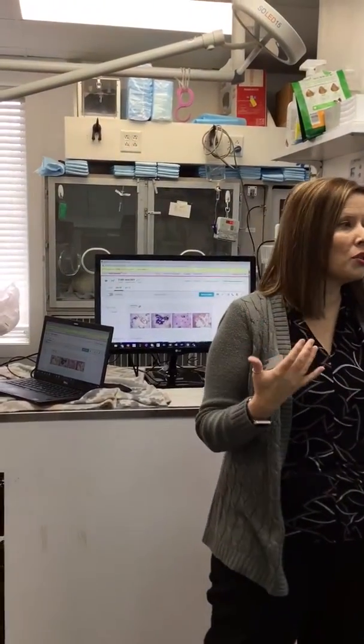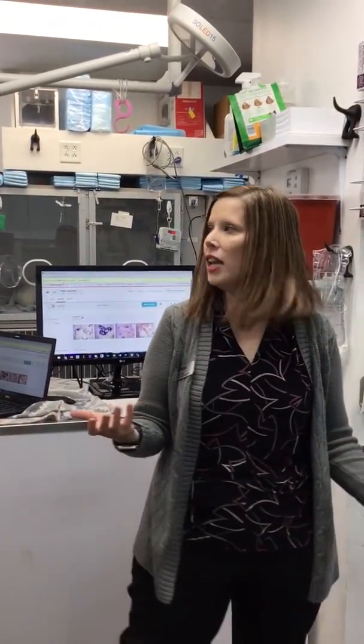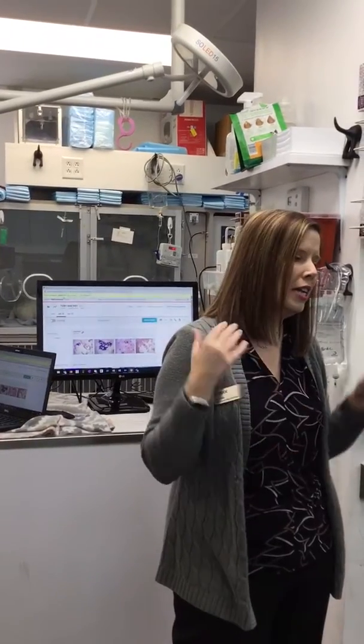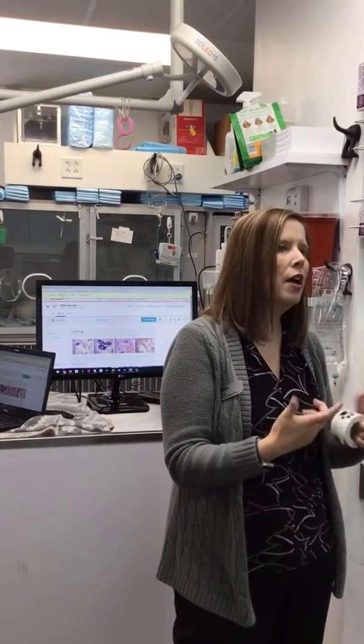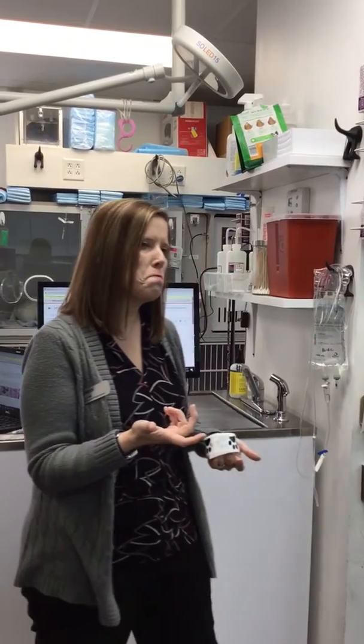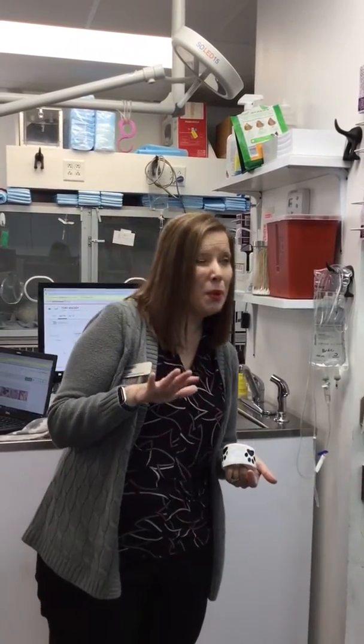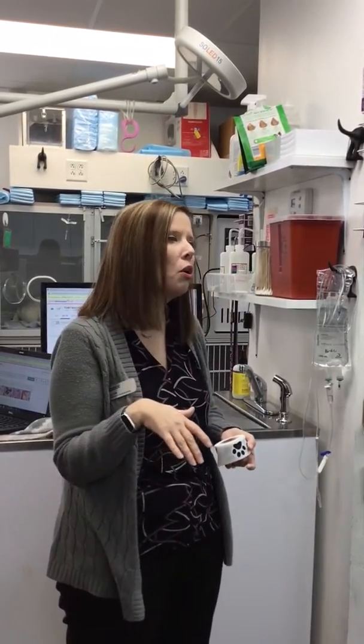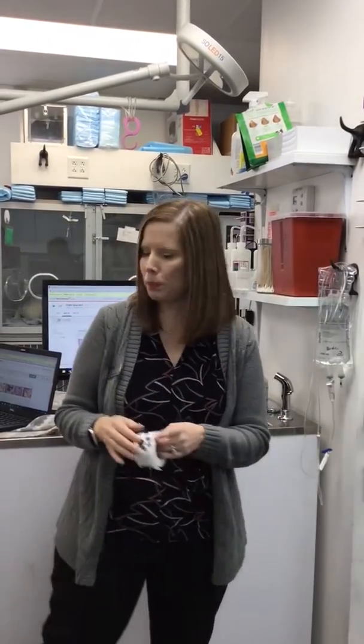I'm sure you've seen sometimes, if you pull blood and you go back 2 hours later, there's no glucose. Have y'all seen that? What happens is after about 30 minutes, those red cells start to leach that glucose. It actually affects some of the other ones too, but that's what everybody knows. So getting it done within that 30 minutes, you're good. Now let's say you know you're not going to be able to run it, you can still put it in a green top, spin it down, then pour that off and put it into an untreated tube, like a white top tube, or you can put it in a red top, but with no clot activator in it, because that could affect it too.